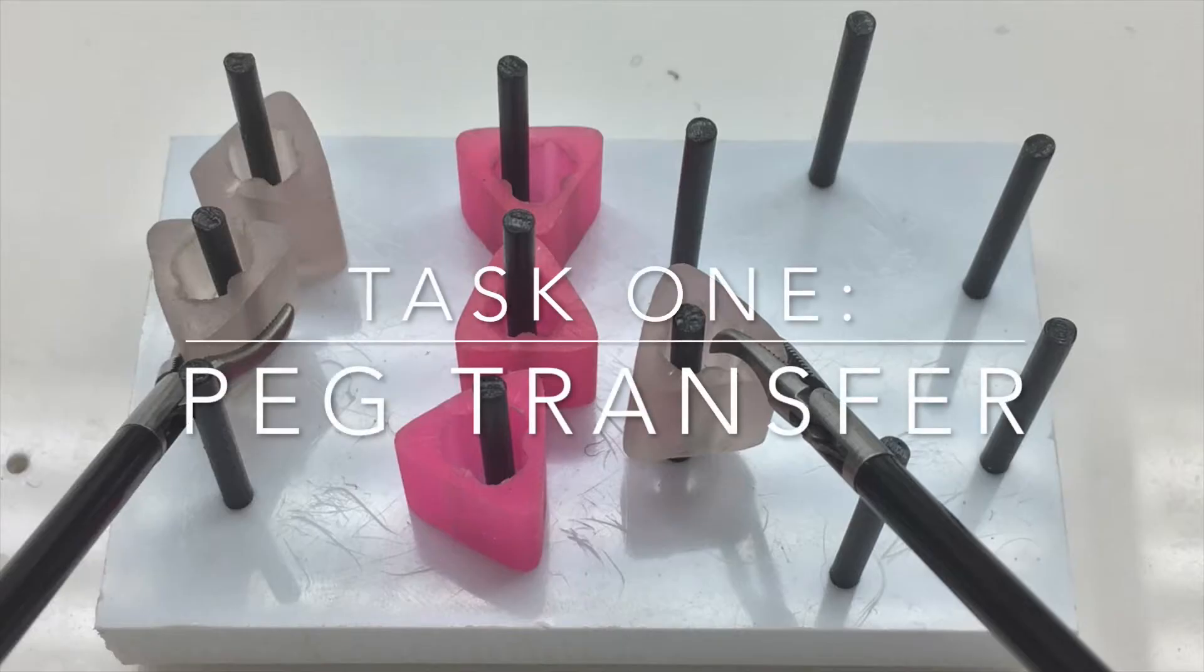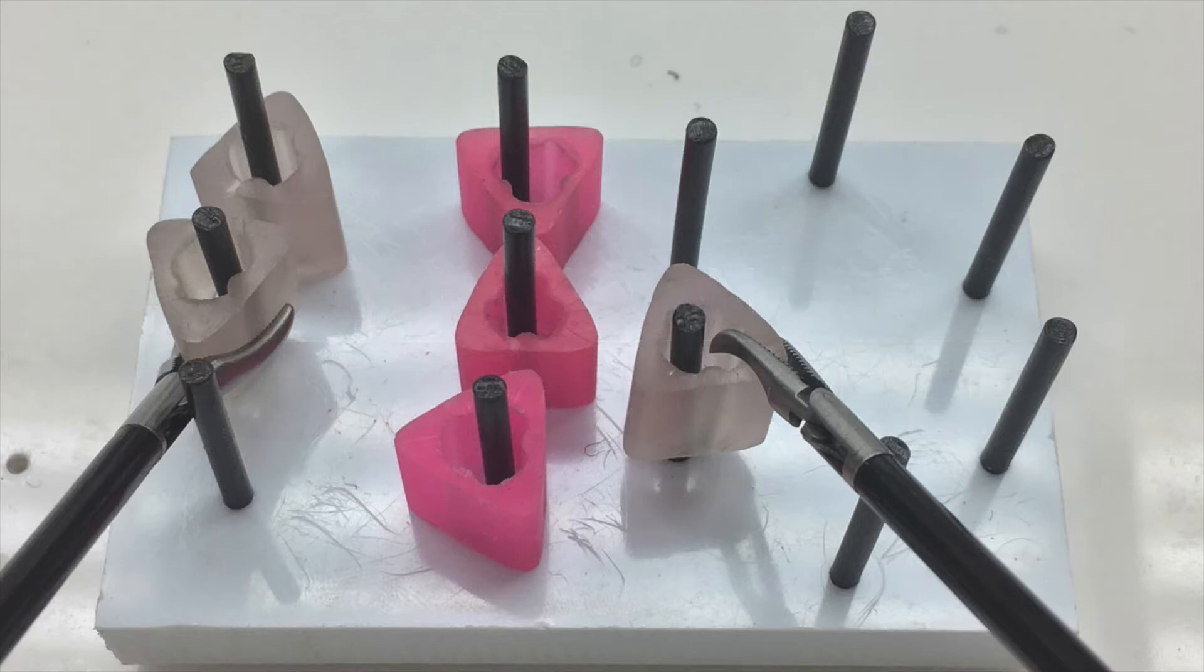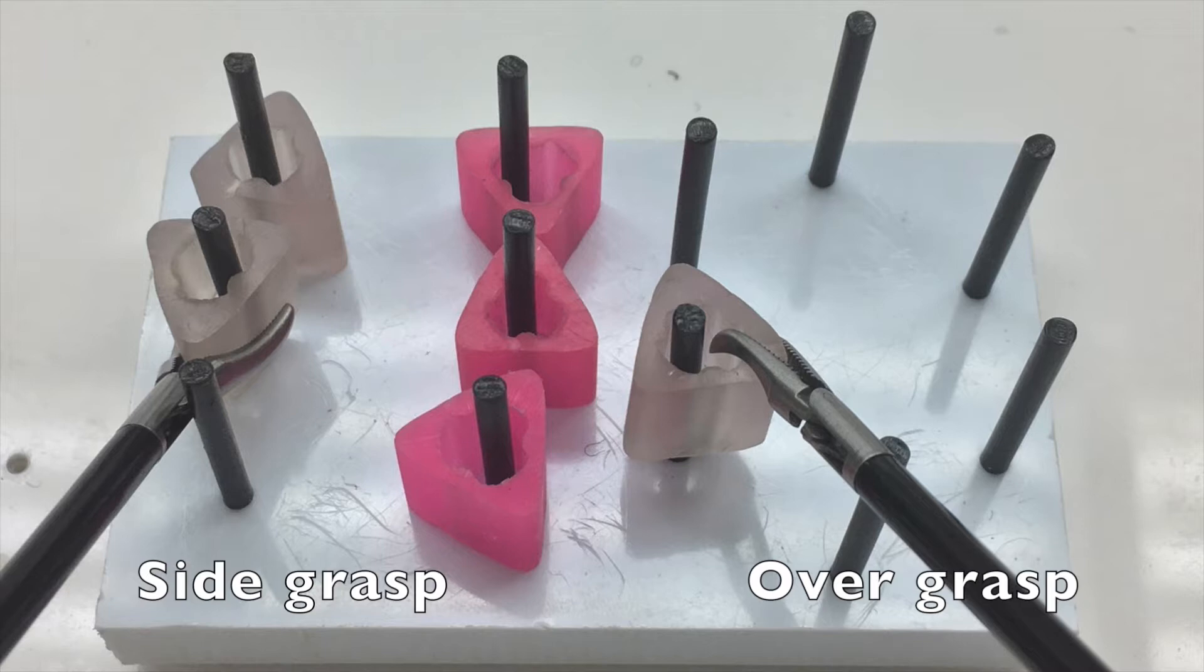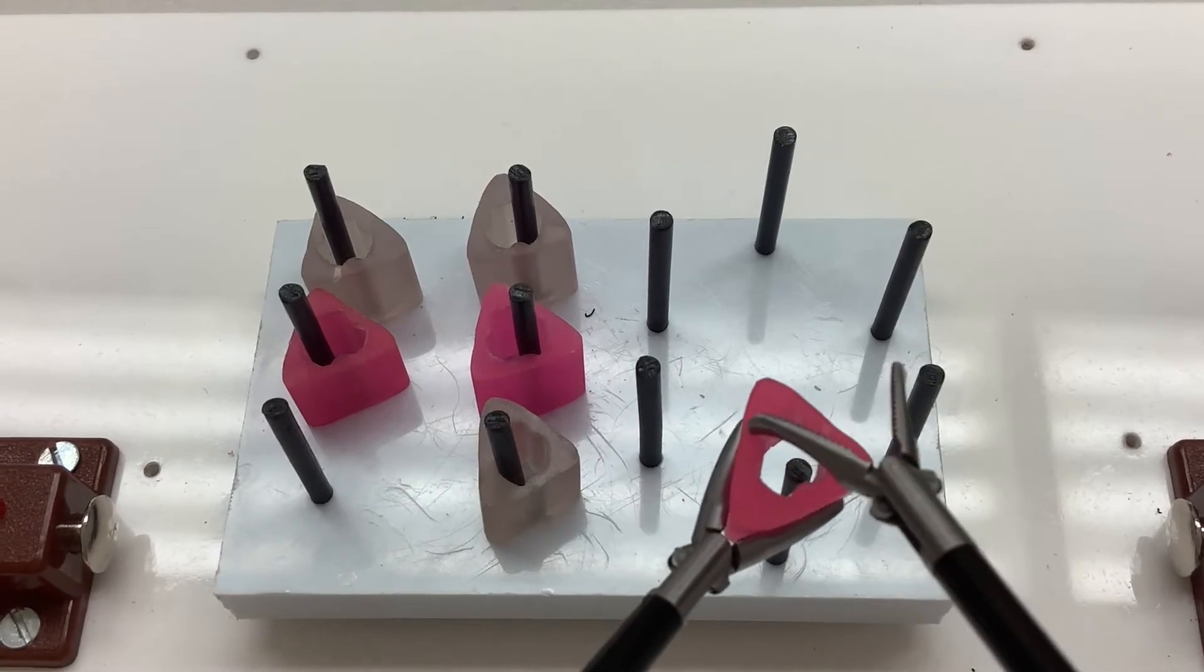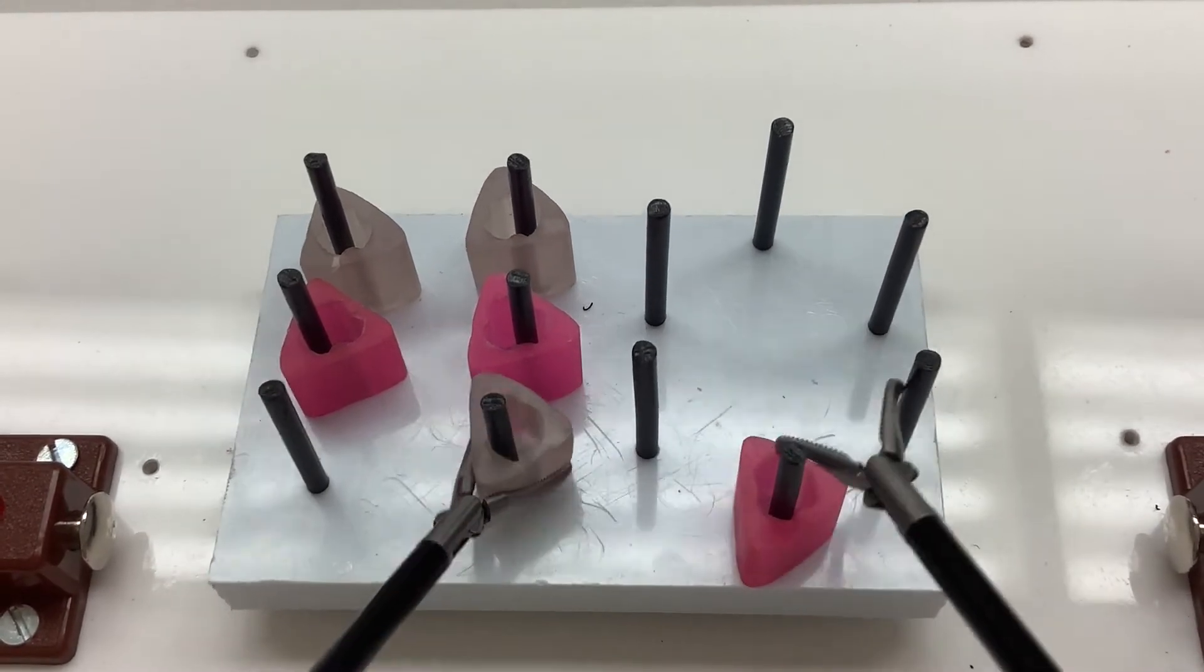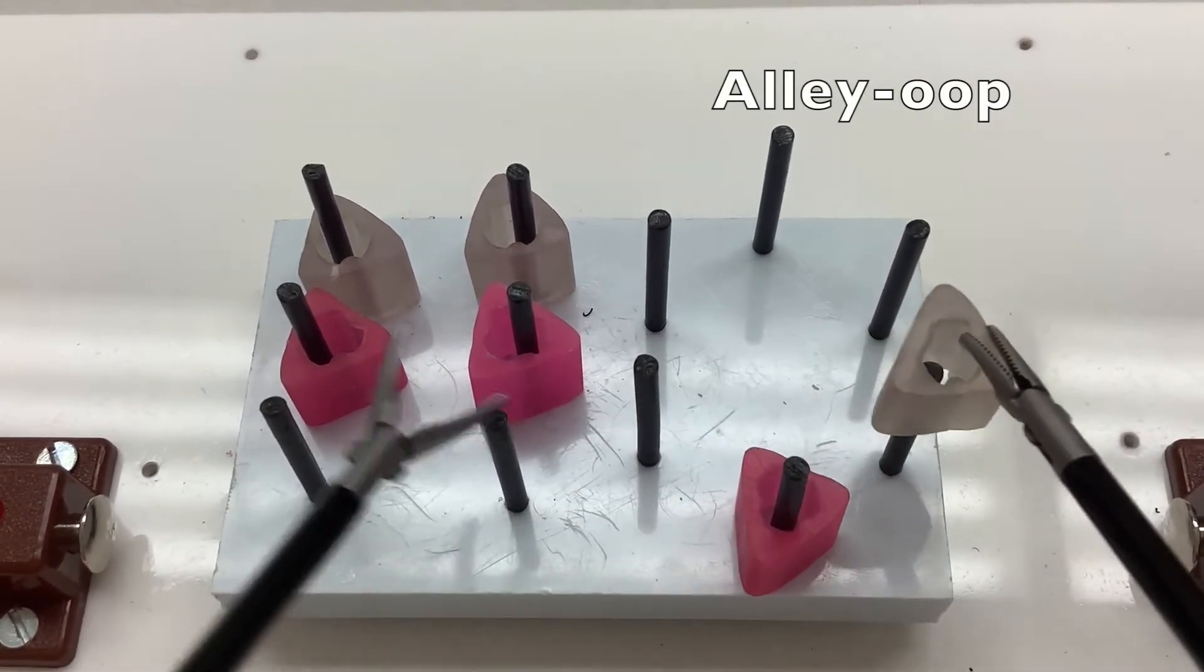Task 1, Peg Transfer. We recommend using a side grasp to pick up each object and an overhand grasp to receive and place the object onto the peg. We recommend passing the object directly over the target peg. We call this the alley-oop method.